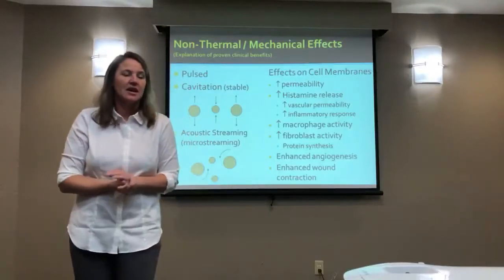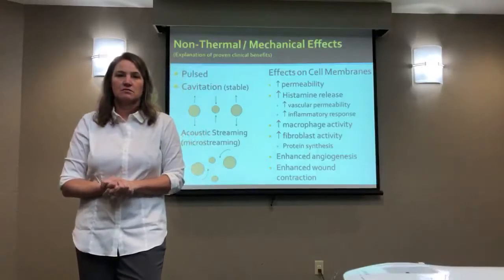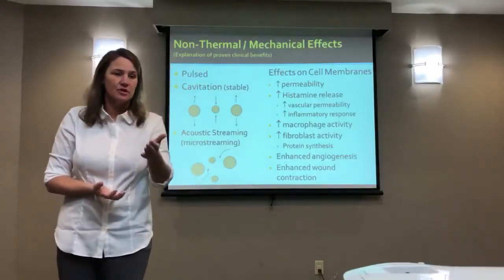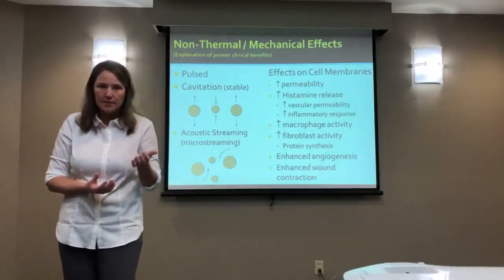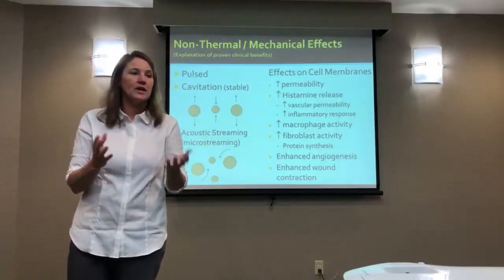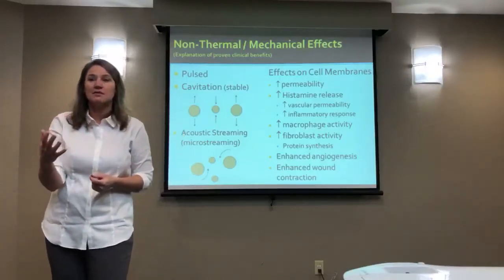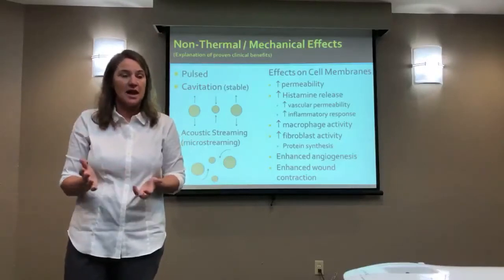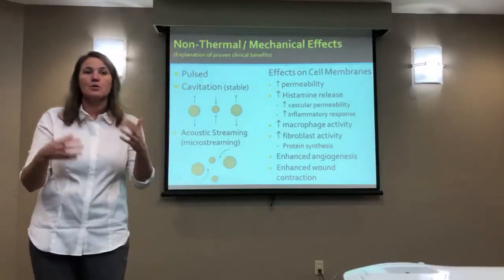We need that. A lot of our patients don't go through that. Think about the people who are always on steroids. They're always on anti-inflammatories, and so their healing process is stifled. Think about the people with diabetes, and they have peripheral neuropathy. Autonomic peripheral neuropathy, the tissue doesn't know it needs to heal. It doesn't know when it gets injured. It doesn't know to move into the next phase. So this is where our modalities might be of benefit, stimulating some of those processes to happen. Ultrasound has been found to promote healing.